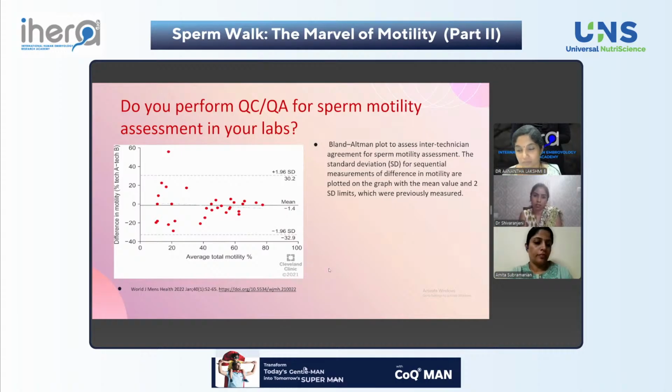If it is less than 10%, then it's fine, because sperm is a motile cell, so getting 100% accuracy is not possible. If someone says right now 3 sperm will be there in that field, and another person comes after 20 seconds, there is a chance the number of spermatozoa will change. But both readings should fall under a 10 to 15% error bracket, not more than that.